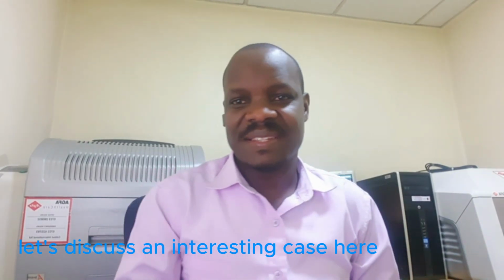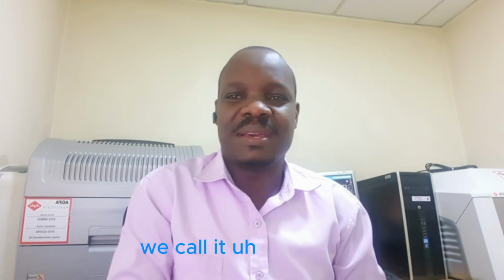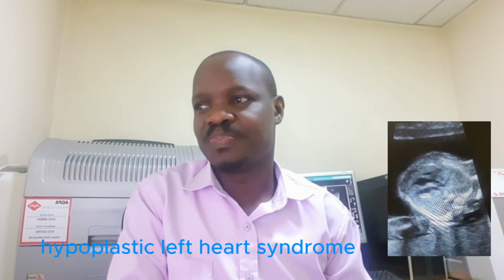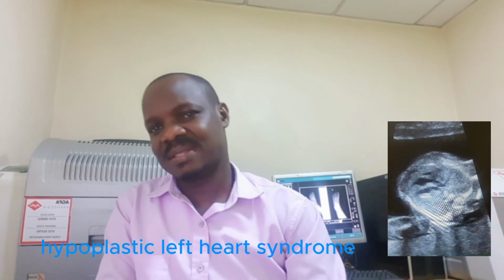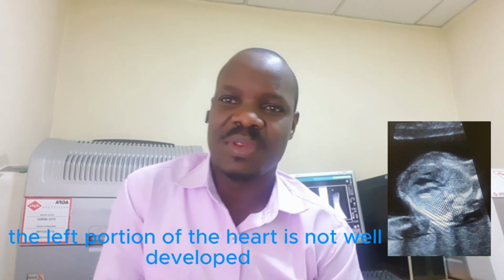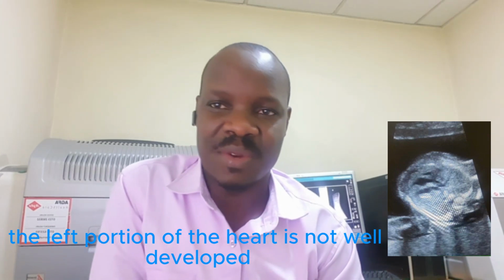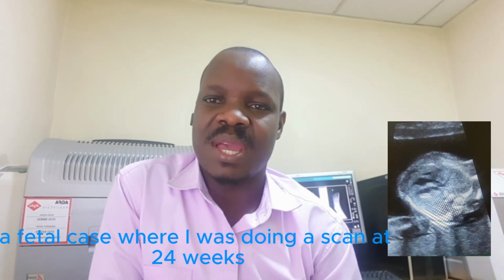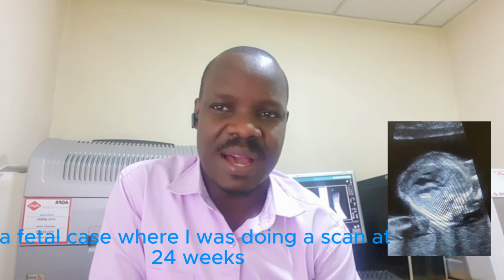Let's discuss an interesting case here. We call it hypoplastic left heart syndrome. What this means is that the left portion of the heart is not well developed. And I'll discuss a case, a fetal case, where I was doing a scan at 24 weeks.